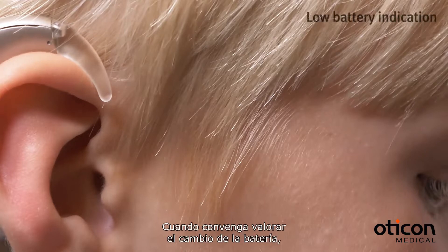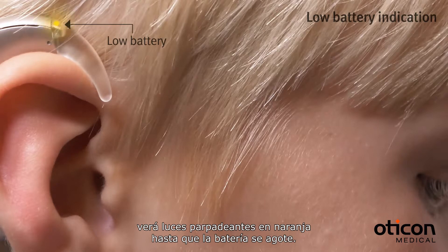When it is time to consider changing the battery, you'll see repeated orange blinks until the battery runs out.